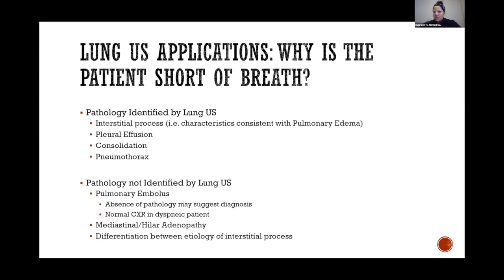You see your patient and you get your clinical history, you get your exam, and then you have your adjunctive ultrasound. And with the combination of these three things, this should help you be able to identify the diagnosis for the patient, or at least the most likely differential. So I'll keep moving on.